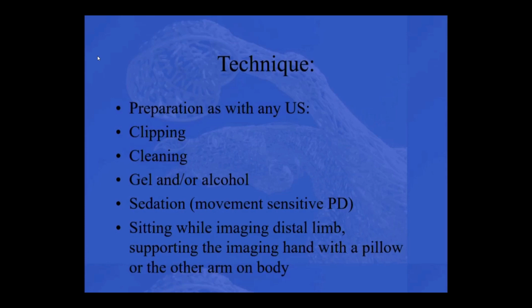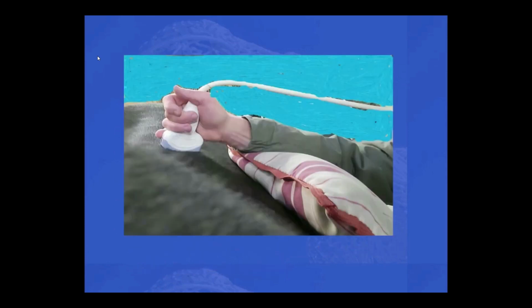Also, when I do multiple passes, I want to make my passes nearly identical. If the horse just moved and did different things, it becomes very difficult to have the same imaging for both passes. So I try to have them not move too much. I find that sitting for images of the lower limb is really helpful to be more steady and not move. And when I do more structures on the axial skeleton, I can use a pillow underneath my arm to have good contact with the horse, and when he moves a tiny little bit, I don't directly have my flash effect.